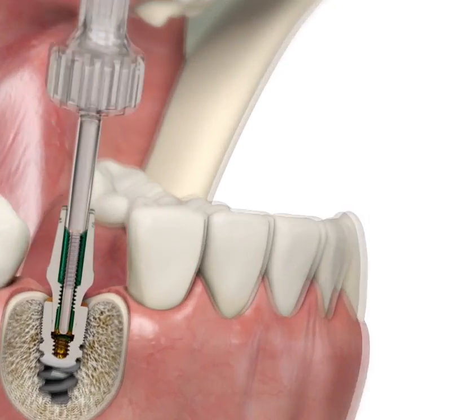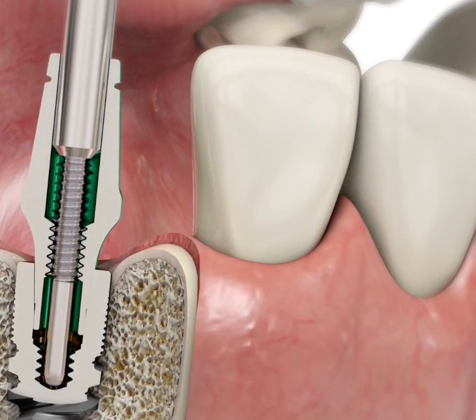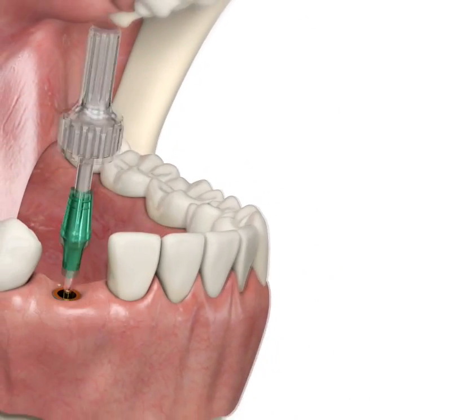Next, take the superstructure's removal tool and place it into the superstructure, then screw it in with a clockwise direction until the superstructure can be removed. Place it in a safe place.